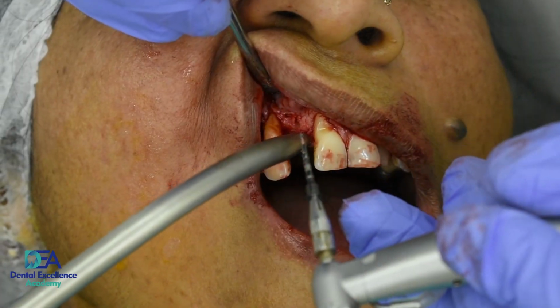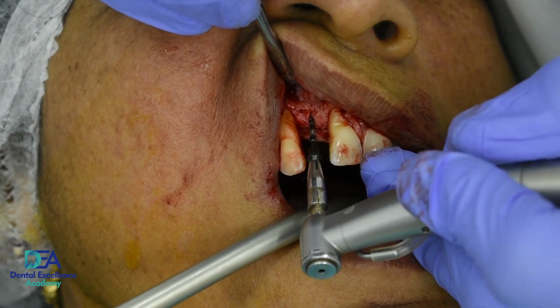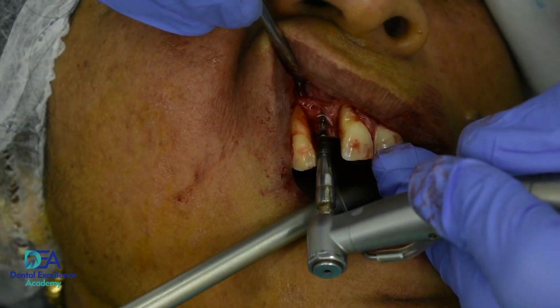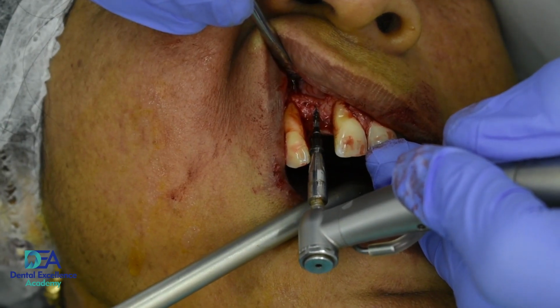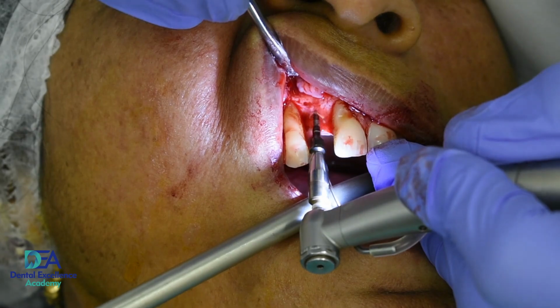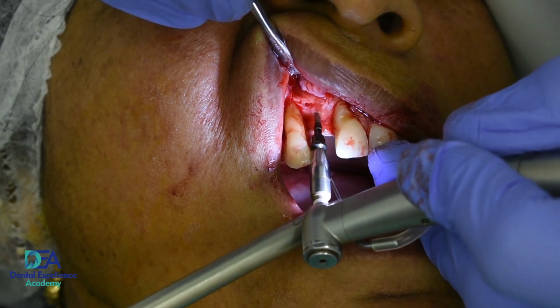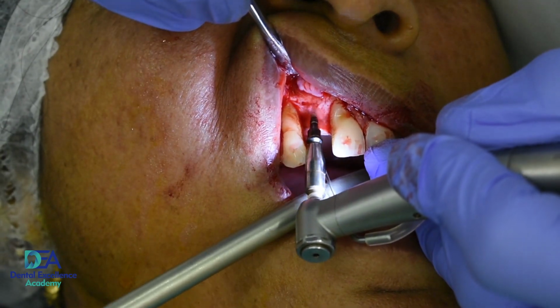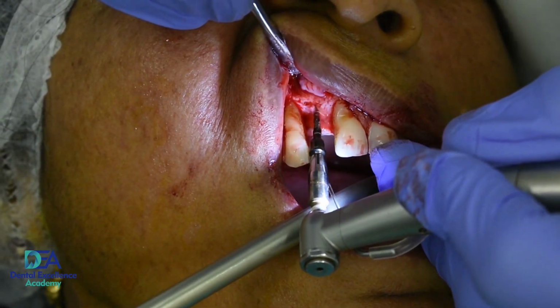So I'm using a drill extender now so that I can go properly to the desired length. My angulation should be from the palatal aspect to the buccal so that our access hole will come on the palatal aspect of the crown.